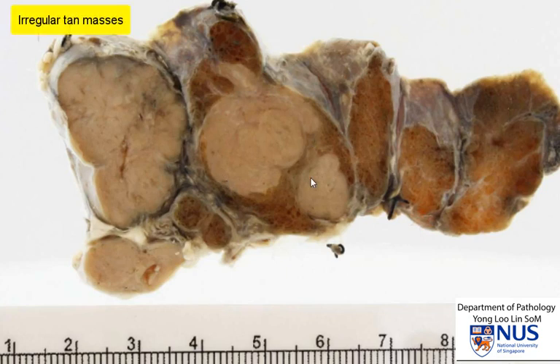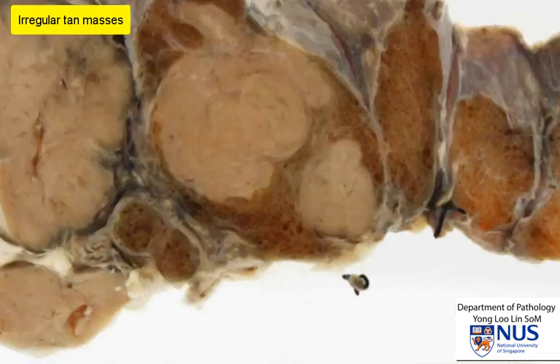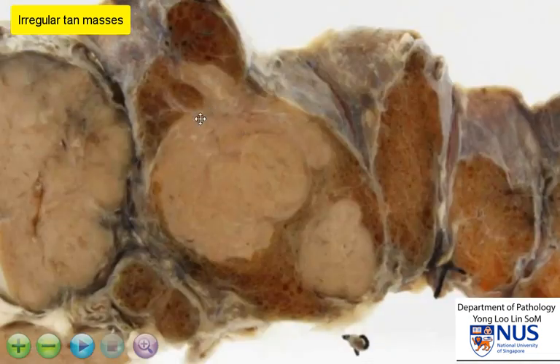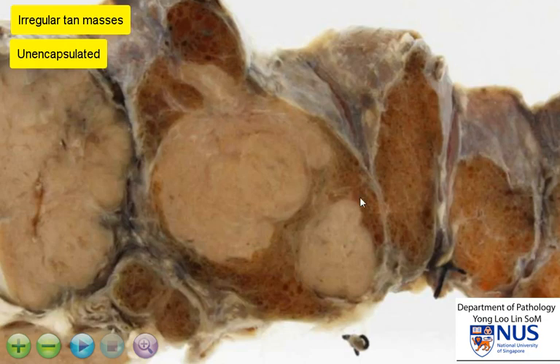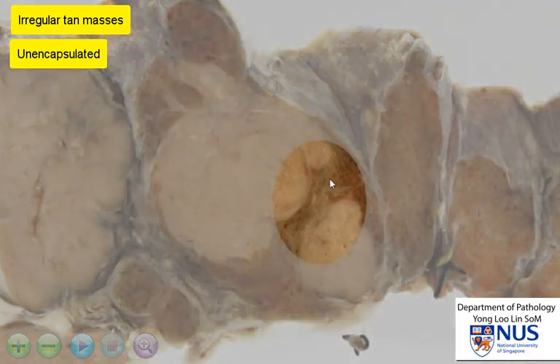These are pale and tan in color, and they are clearly not encapsulated. In some areas, they are fairly well demarcated from the thyroid parenchyma, but in other areas, the distinction is not as sharp.